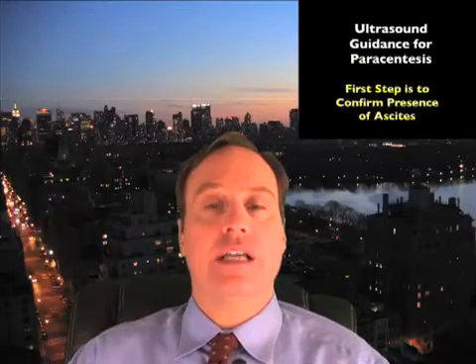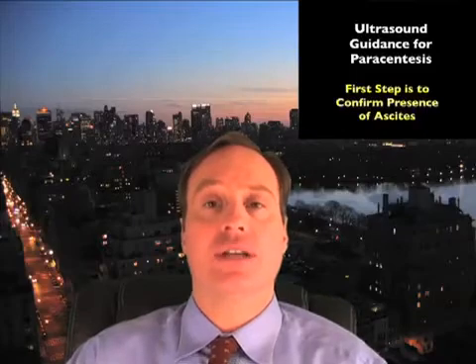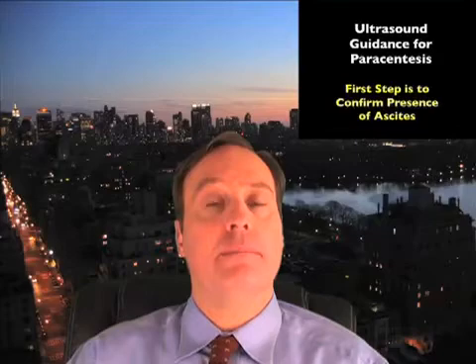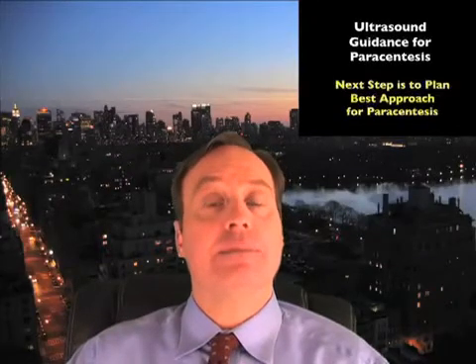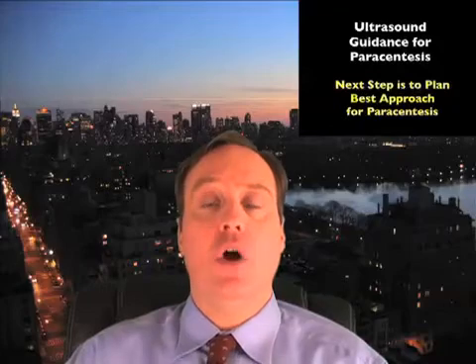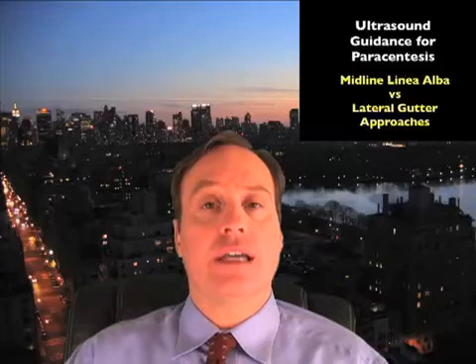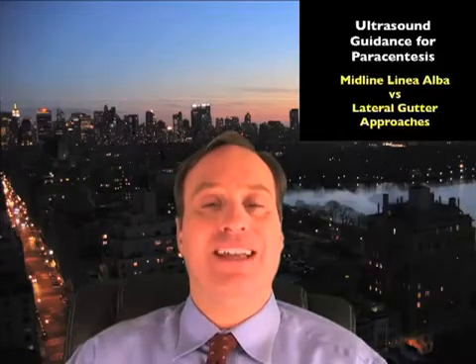Step number one, when deciding if a paracentesis procedure is necessary, is to determine if the patient actually has ascites and if there are significant areas of fluid pockets amenable to a drainage procedure. The second step is to best mark the location for needle placement using bedside ultrasound. The two techniques that have been used are the midline linea alba or the lateral gutter techniques, and bedside ultrasound can help you decide between the two.